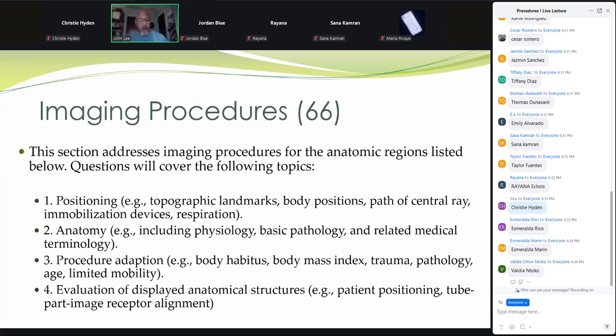It's good for when you're working, but for the registry, they want to know what is taught in the texts. So you have a text, make sure you review that information. The angles and tube angulation, body angulation, positioning lines, all of those degrees are all important numbers to know. So you're going to have to make sure you buckle down and go through those as well.